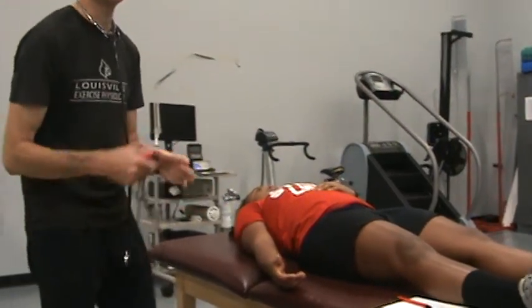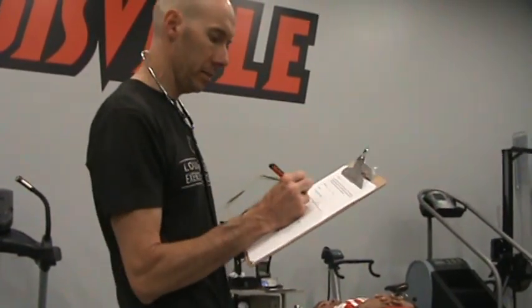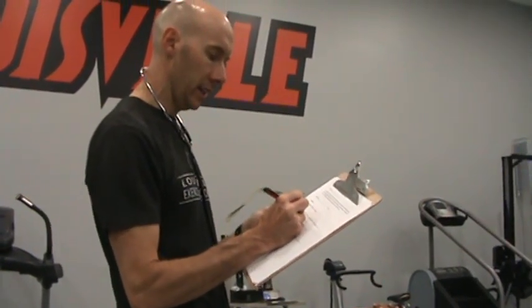All right, counting 65 beats, so her supine heart rate using the 60-second palpation method was 65 beats per minute. Remember, the unit for expressing heart rate is BPM, otherwise known as beats per minute, okay? All right, so now we will go ahead and measure her blood pressure in the supine position.